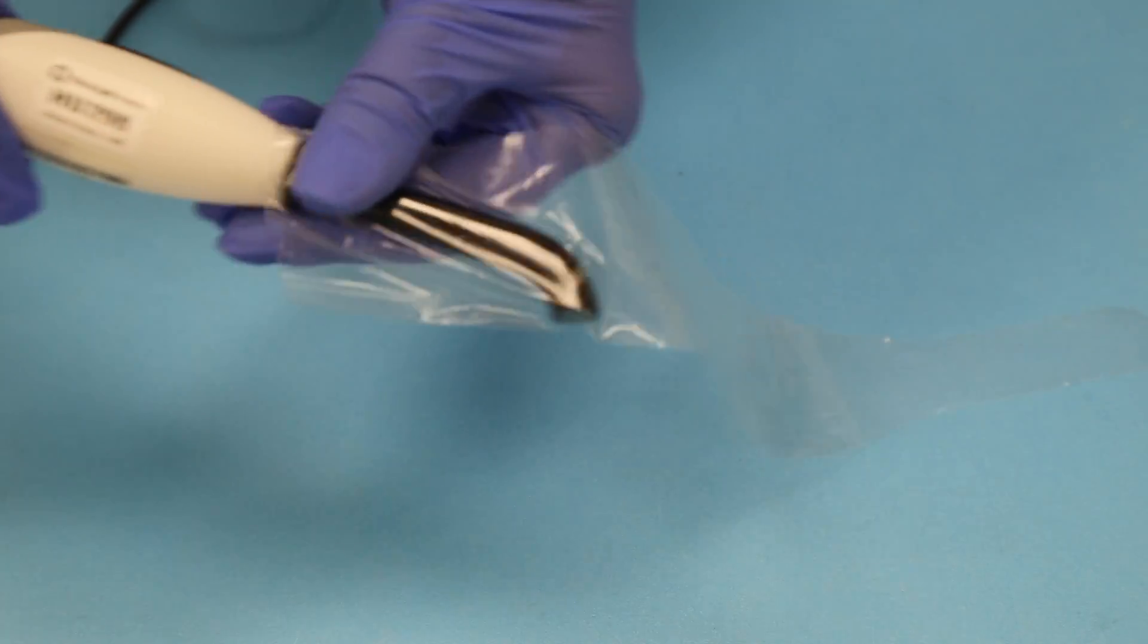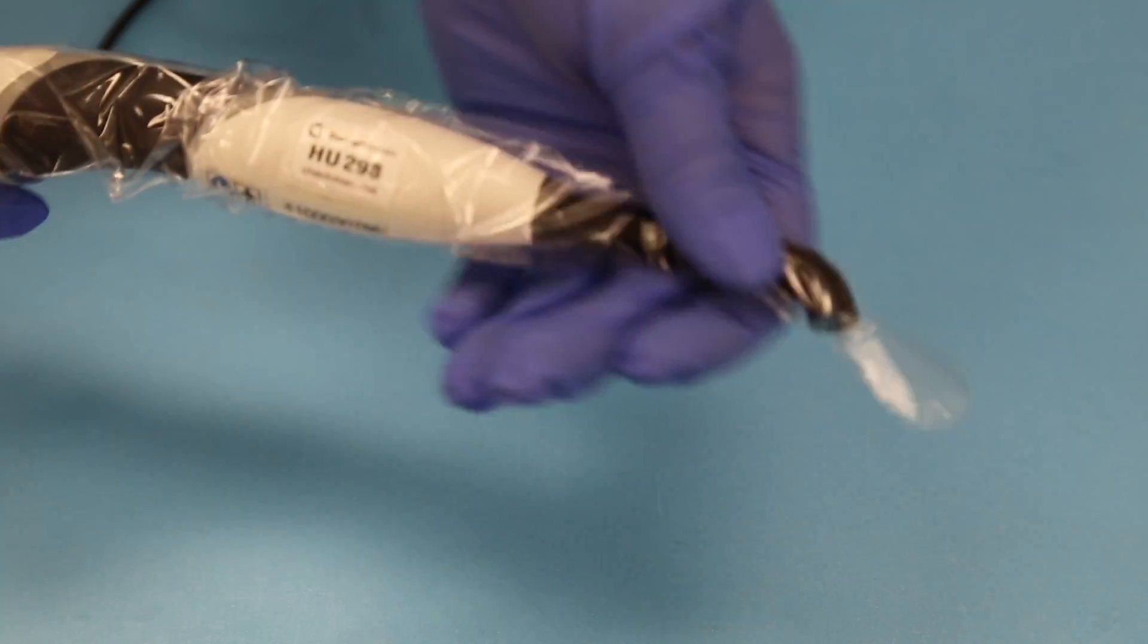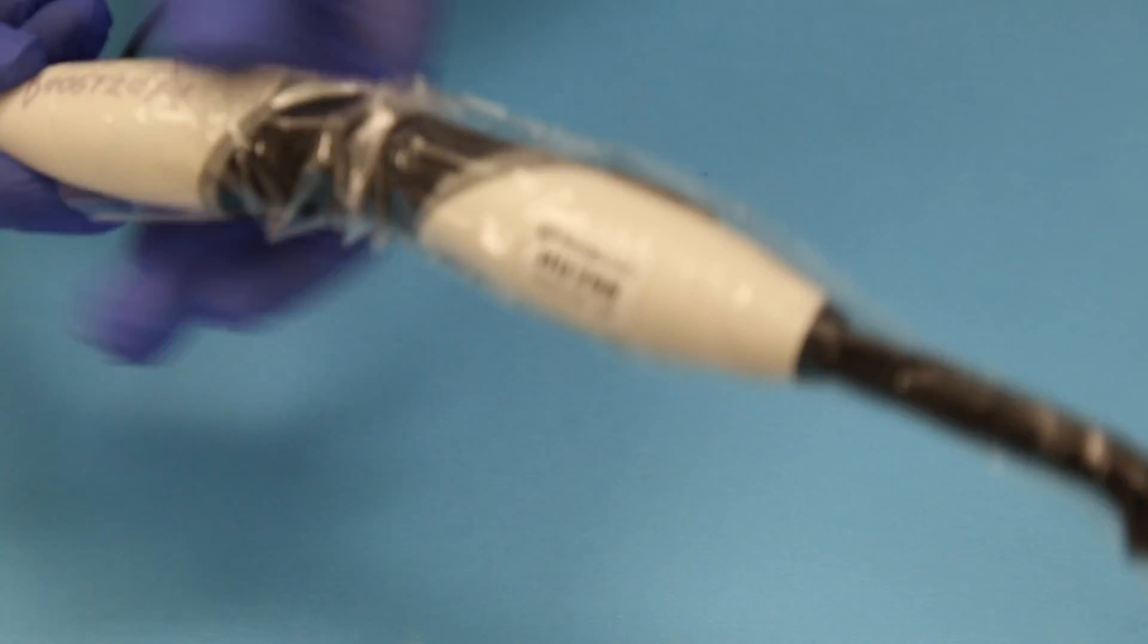Otherwise, the sleeve will stick to the light and it will be very hard to put on. Here we can see that the style sleeve fits the light snugly and covers all the buttons.